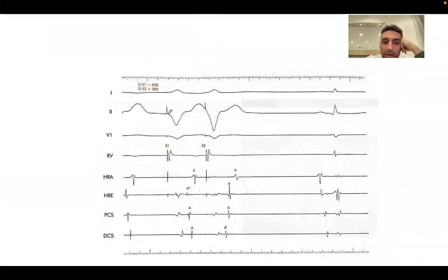You are V pacing, ML, if you want to take this one. So this is your V pacing. Let me orient you. S1, V paced, is your V signals, your A signals, and then S2, V, and this is your A signal. So what do you observe, ML? And this is your sinus subsequent beat, A, H, V, okay? What do you note here?